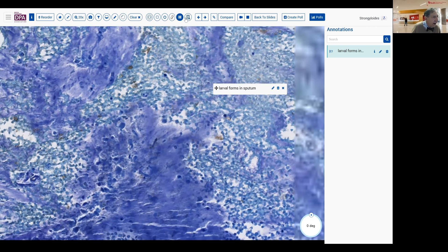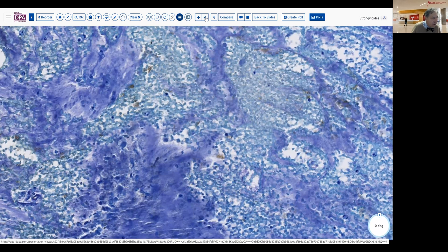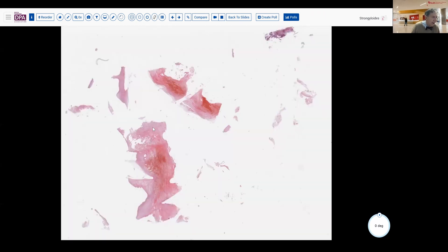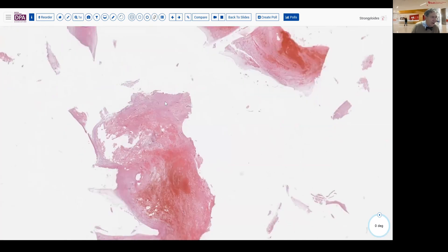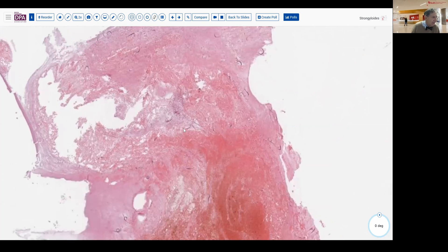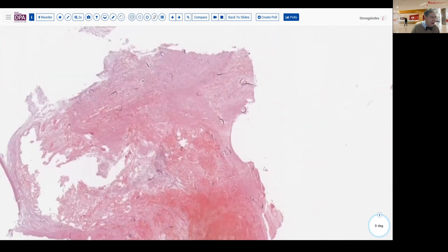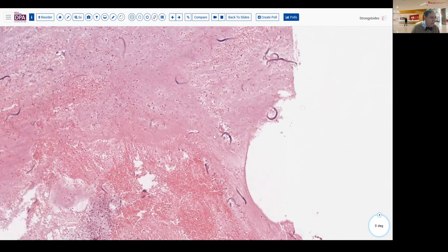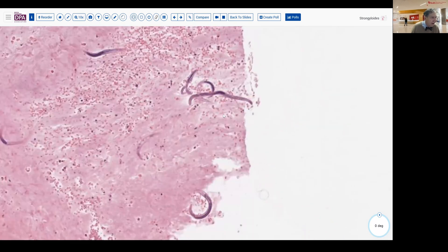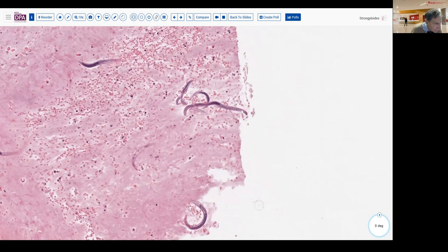In our next slide, also a sputum sample. This one stained rather with hematoxylin and eosin from sort of a sputum cell block that was concentrated. And I think you can see at low magnification that it's just filled with larval forms here in this sample. You know, worm after worm after worm here in the structure.